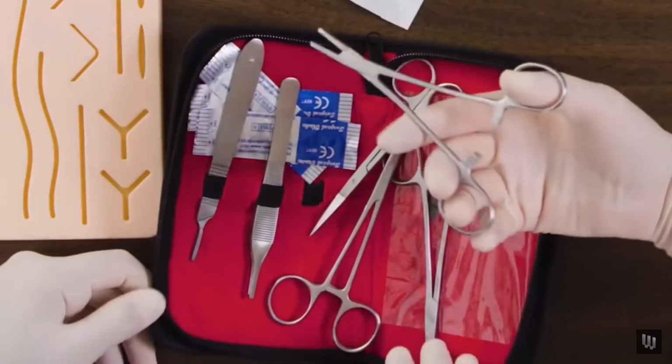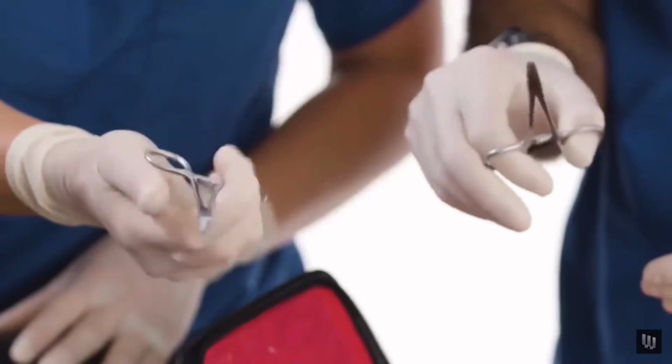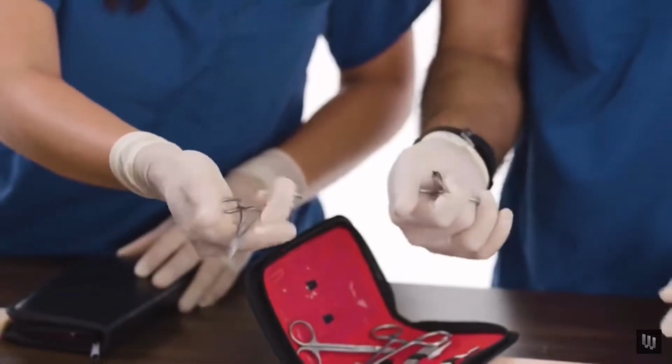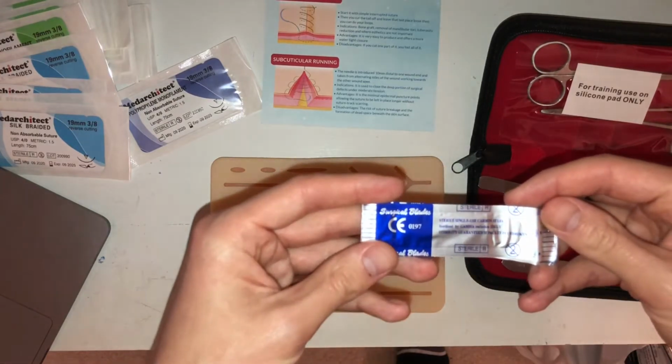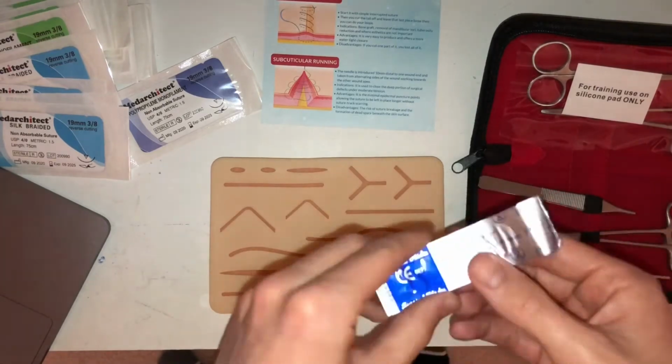So the first thing you have here is a needle driver, and every surgical instrument locks in place. So practice that mechanism, and real surgeons don't put their thumb in that hole. Push it with the butt of your hand and then close it. All right, so we need the needle driver. So here are our sterile single-use carbon steel surgical blades, okay. Practice surgical blades.